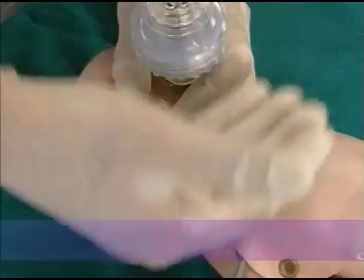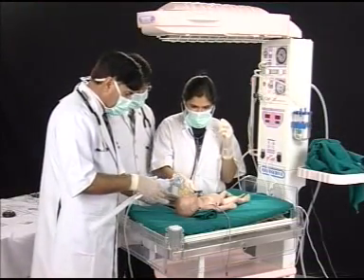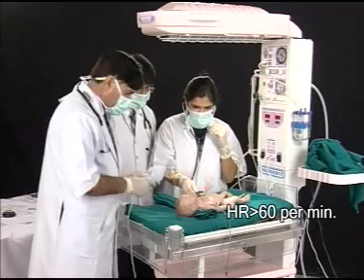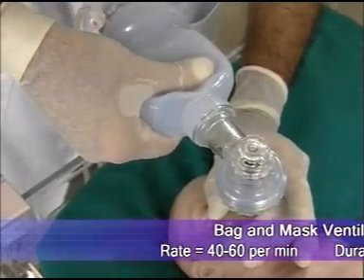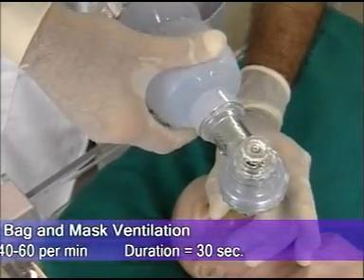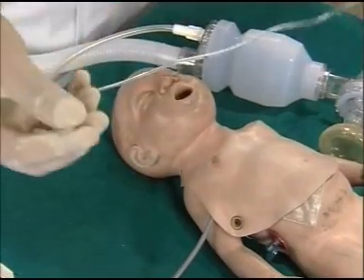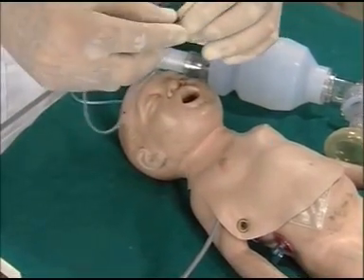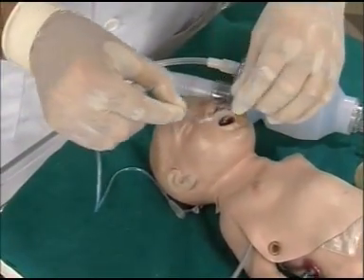If the baby is still not breathing and the heart rate is more than 60 per minute, bag and mask ventilation is continued. If the baby requires bag and mask ventilation for more than two minutes, decompress the stomach and an NG tube is passed.